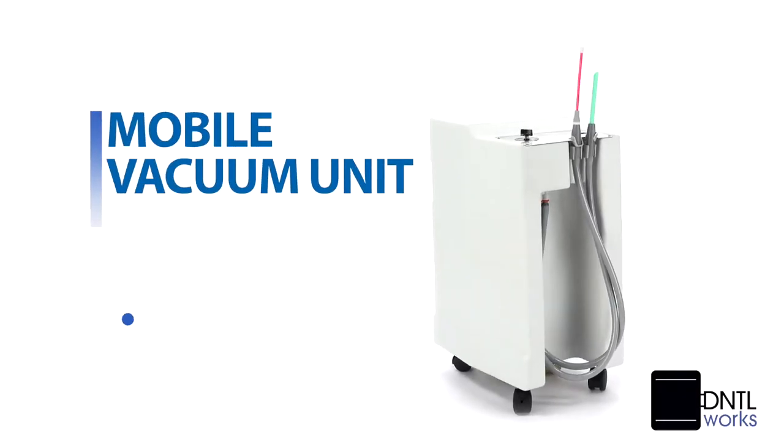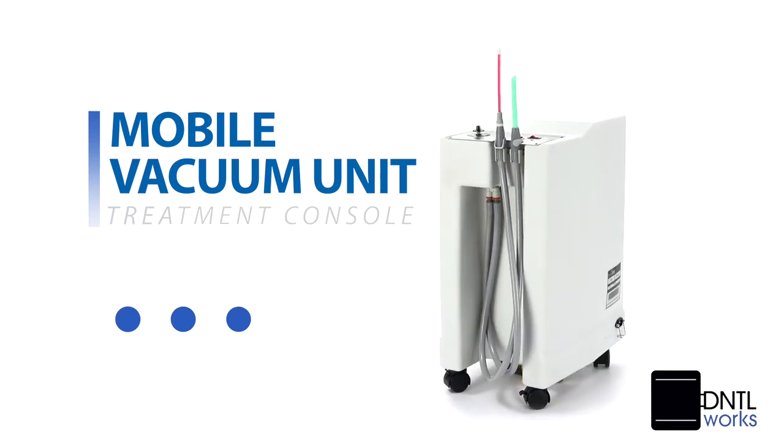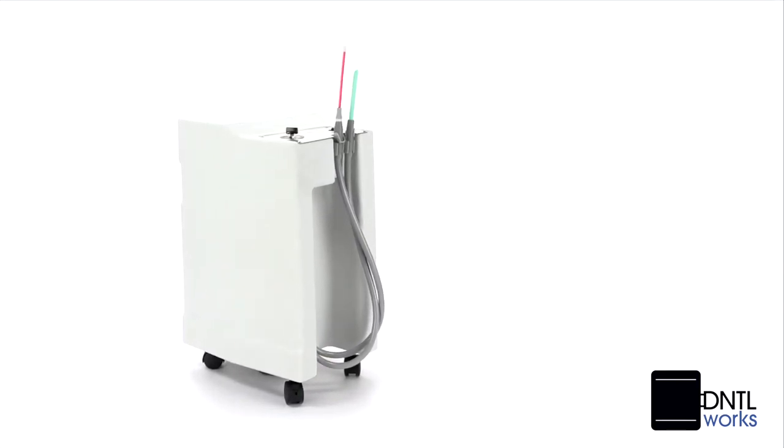The Dentalworks mobile vacuum for in-office use is the practitioner's perfect alternative for environments in which the central installation is impractical or non-existent. It's compact, measuring only 13 by 16 by 26 inches.